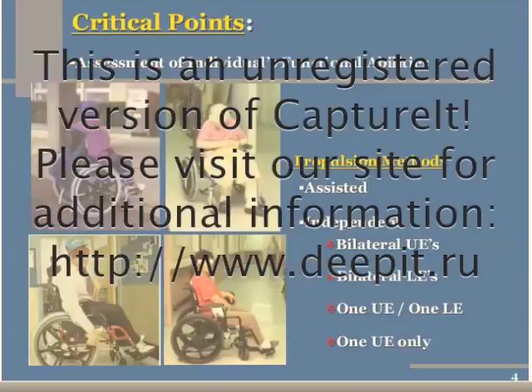As we begin to create this feature list for the mobility base, let's first focus on use of a manual wheelchair and consider how the individual will propel the chair. Will the propulsion method be assisted in that a caregiver pushes the chair, or independent? If the individual independently propels the chair, how does he or she do it?